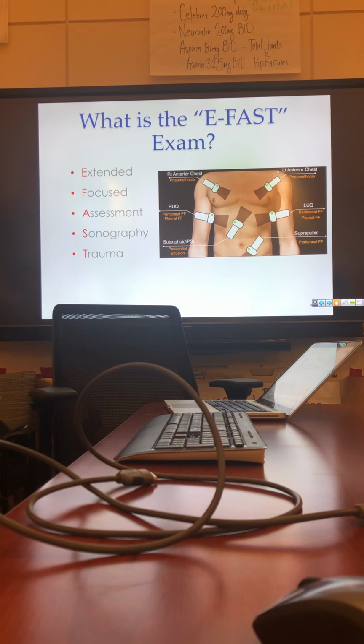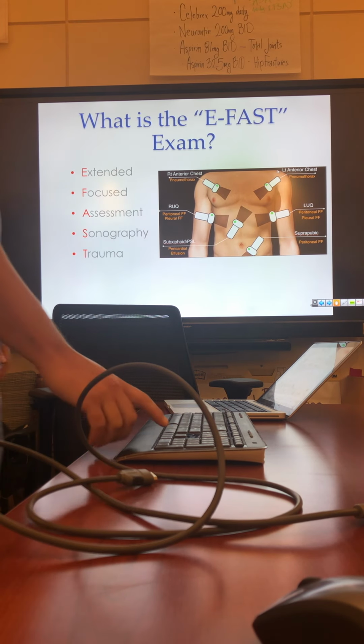Anyway, it is very good. To be honest, it probably won't replace the chest X-ray anytime soon. I think we're more comfortable with chest X-ray and all of that. But like I said, in somebody who is unstable, who you don't want to wait for X-ray, it can be very useful and very accurate. Okay, so those are our six views.